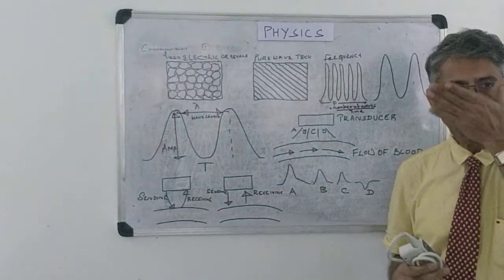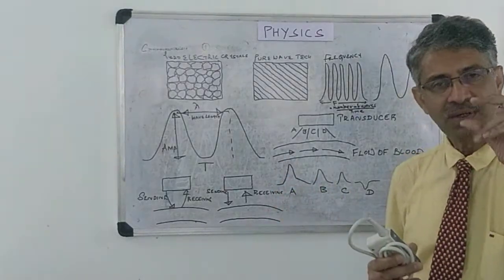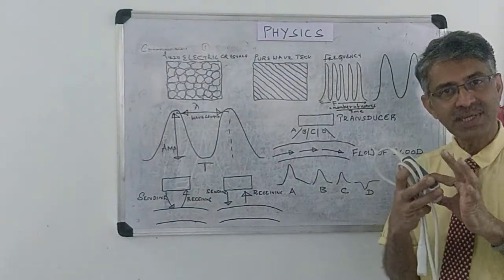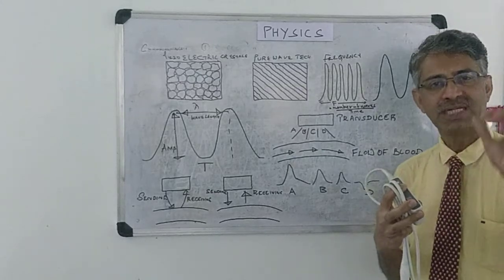So in a nutshell, one should know what is sound, what is ultrasound, what are the components of this transducer, how it works, and of course a short note on Doppler.